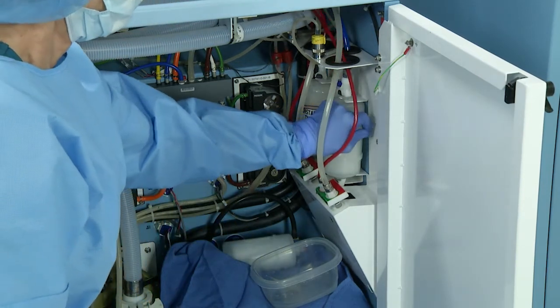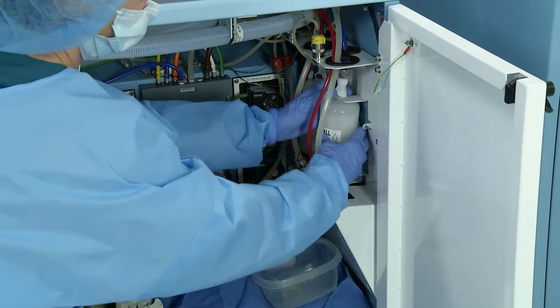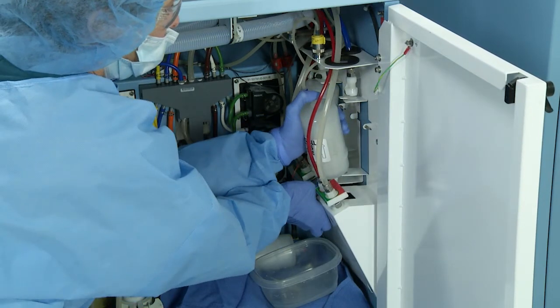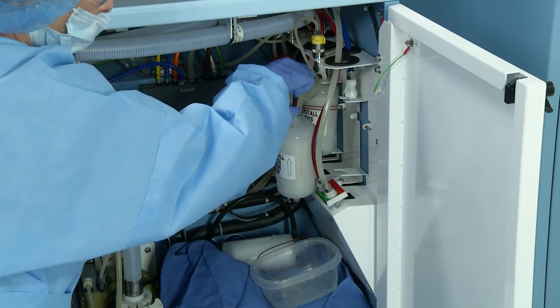Unhook the rubber band holding the filter housing and unfasten the top quick disconnect by pulling it up. Place your finger over the hole and continue to hold your finger over the top hole. Next, unfasten the bottom quick disconnect by pulling it up. A small amount of water may drip.